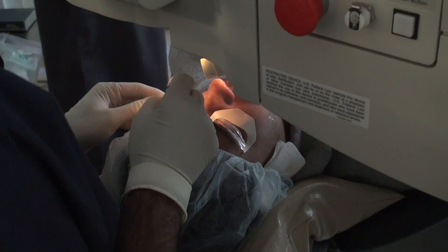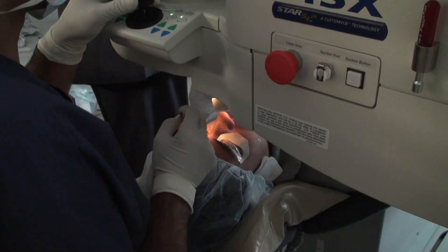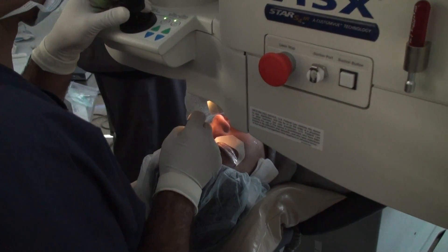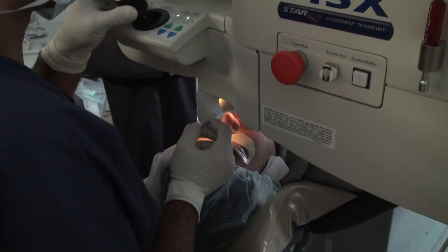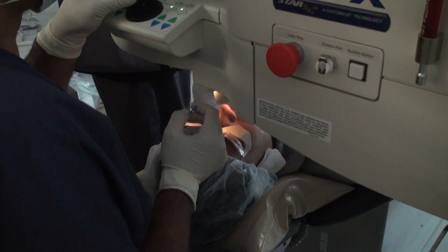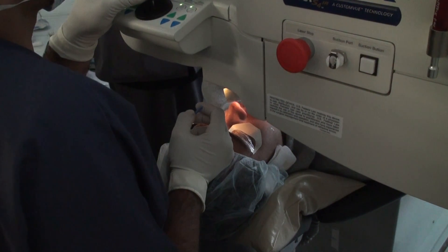The left eye is 28 seconds for your treatment — keep looking at the flashing light. It's ready, it will move out of range. Put your chin up a little bit. Go in range, everything is ready, and it's 28 seconds.